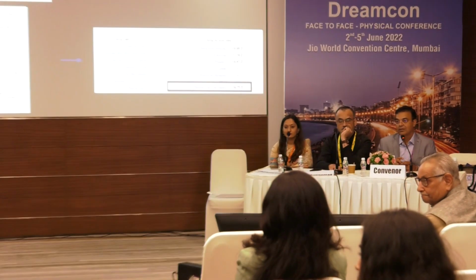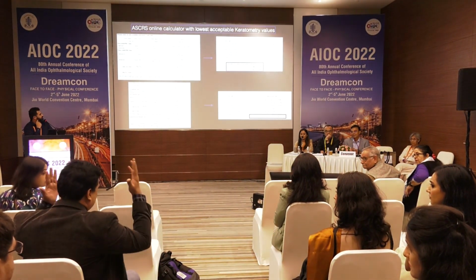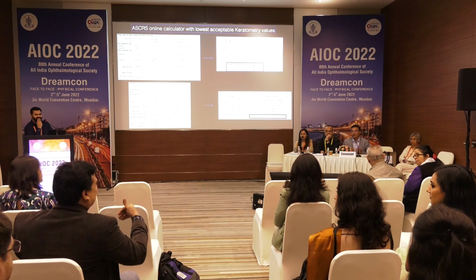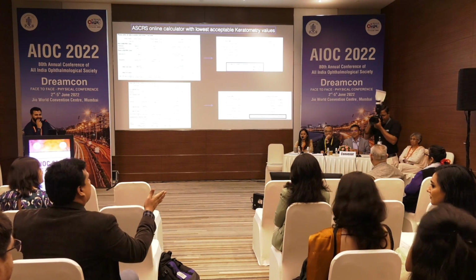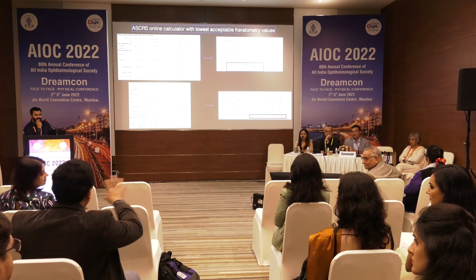Yes, you can. In the past, that's what used to hold the best. I had a similar case in which there was a post-RK, post-LASIK, in fact the LASIK was done twice. I had a similar one, 22 or 23 diopters. I was getting an IOL power between 23 and 26 from different calculations.